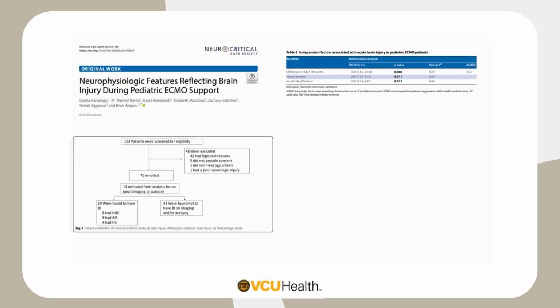So think of a patient with a normal waveform on the left MCA and a dampened or blunted waveform in the right MCA. That patient has a marker that is independently predictive of brain injury in our study. To my knowledge, our study was the first to show a strong statistical signal of a TCD biomarker for brain injury in pediatric ECMO.